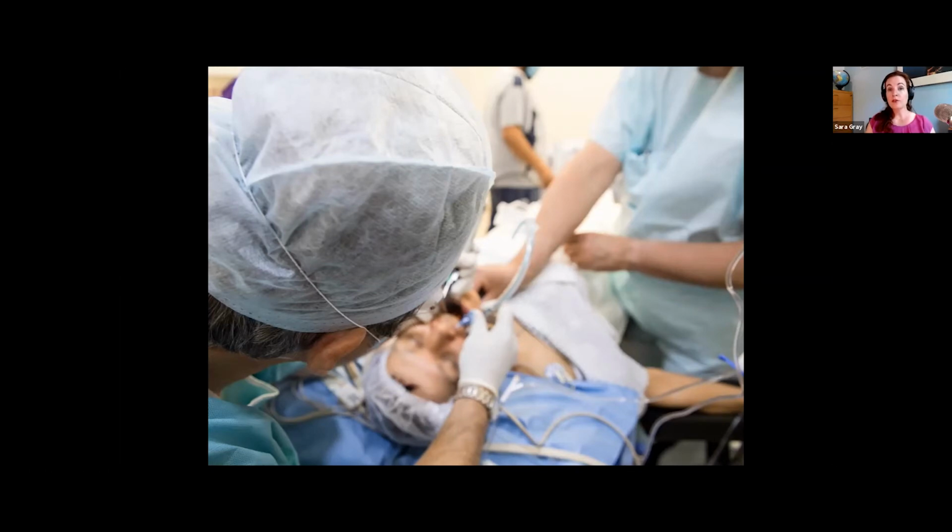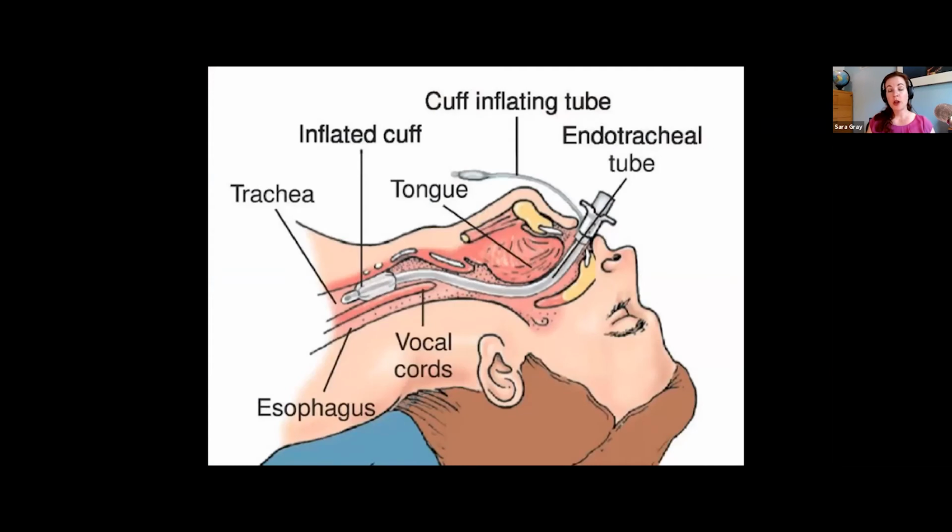What we want to avoid is the situation where the airway is very swollen and we take out the endotracheal tube. If the endotracheal tube was all that was stenting the airway open, when we remove it, they can have acute airway obstruction, which we don't want. So when you deflate the balloon and hear that whoosh of air, you are confirming that there's space in the airway around the endotracheal tube, which is a sign that it's safer to extubate this person.